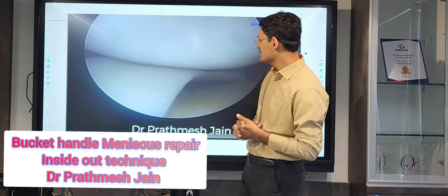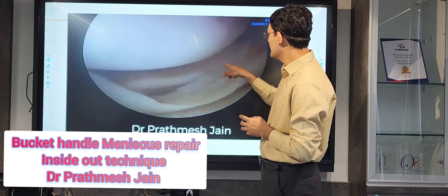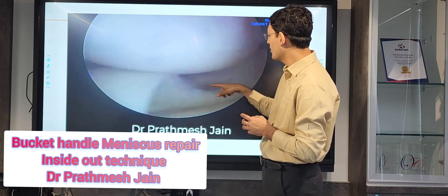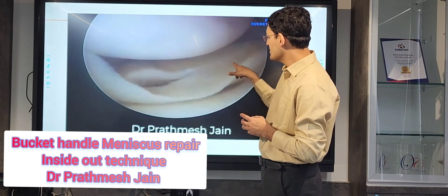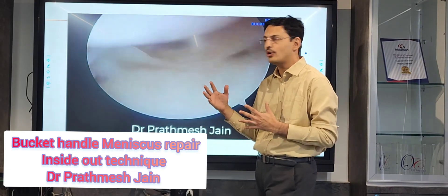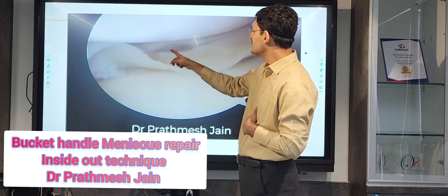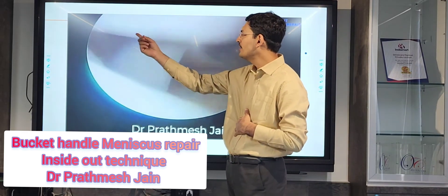This is one such case in which the patient has a locked bucket handle tear. You can see that the femur is on the top and the tibia is on the bottom. There is a tear present — this is a locked tear, and sometimes it is a double locking, meaning you have two levels of tear: one here and one on the back side.